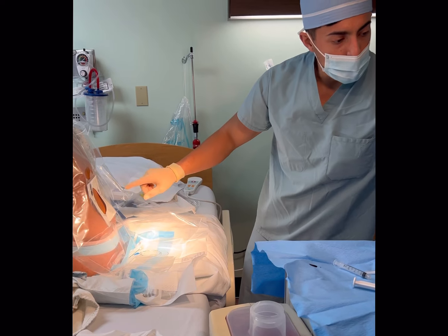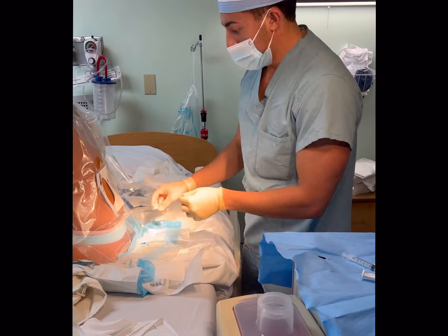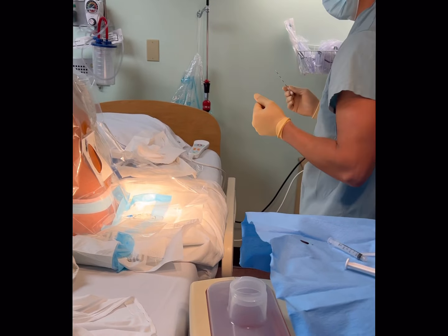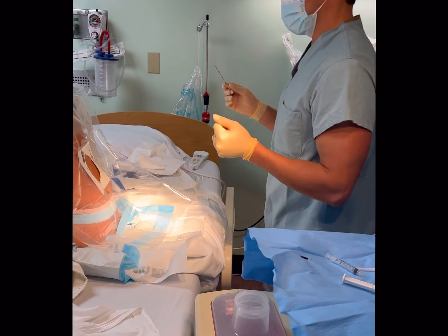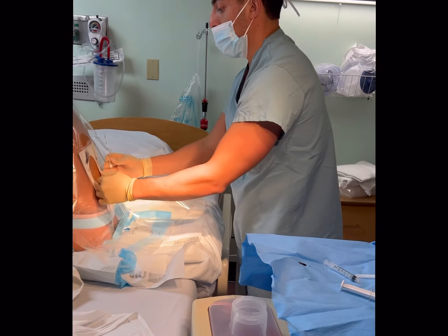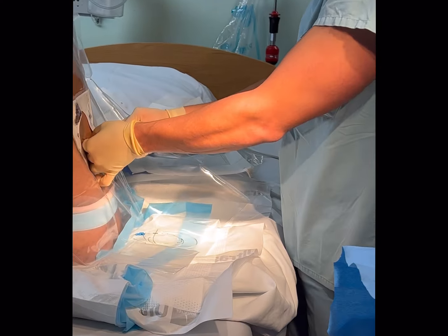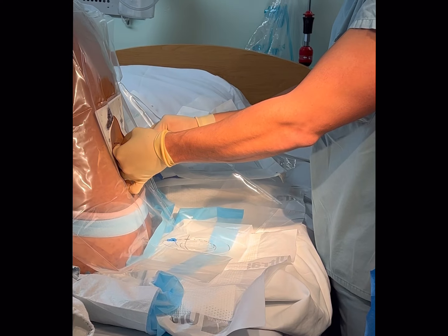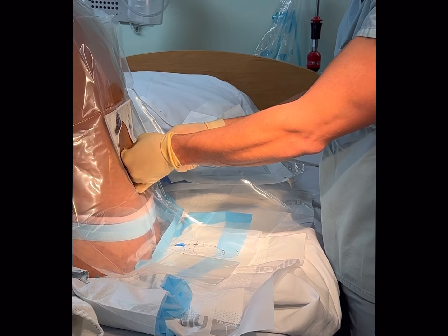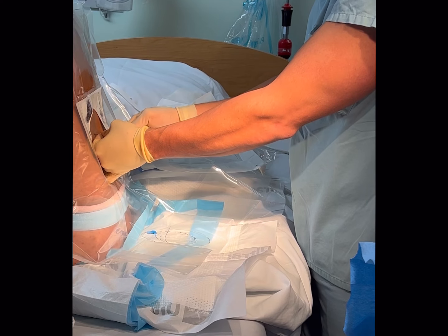I have my mark here where I did the local anesthesia — you can see a little plug there. She should be well anesthetized in that area. I'll engage my Tuohy. I'm going to go until I feel it engaging into ligament. It's a little looser than I like — I want it a little tighter engaged. I'm hitting off bone, so I'm going to redirect just a little bit. That feels a lot better.